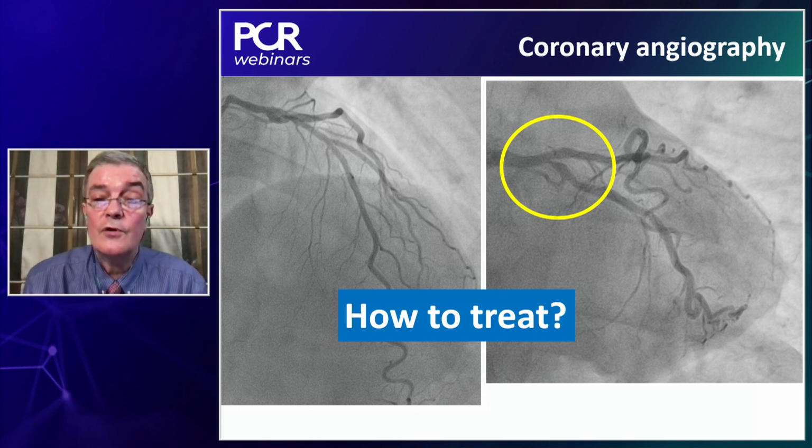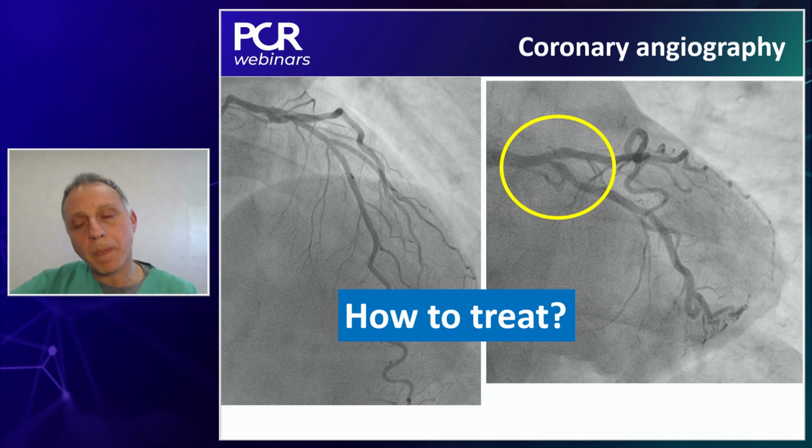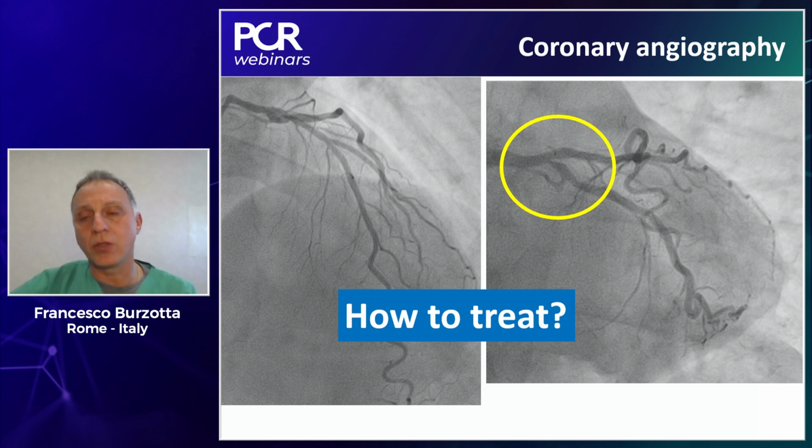and we put it in our consensus document just to share with the community the importance of understanding that provisional does not mean single stent. Francesco, you are the first author. Please elaborate briefly on that, because people frequently ask if provisional is a single stent strategy. No, we really do not think this. We know that the concept of bifurcation intervention is that the operators should have a plan, and the plan cannot end most of the time with just putting in a stent.